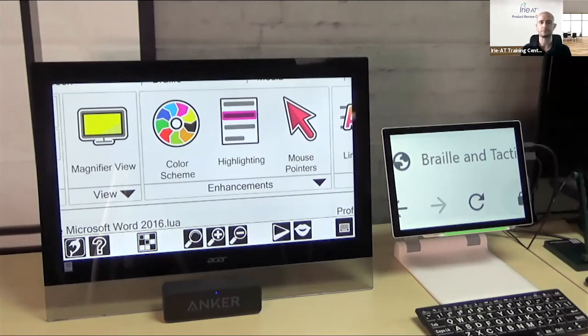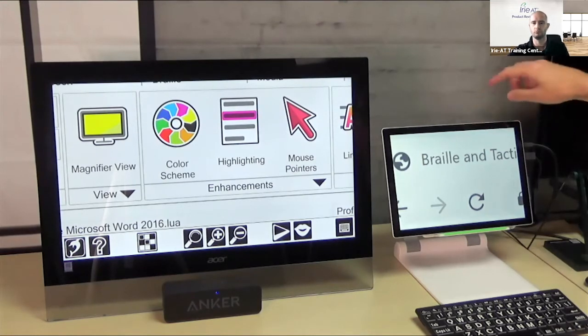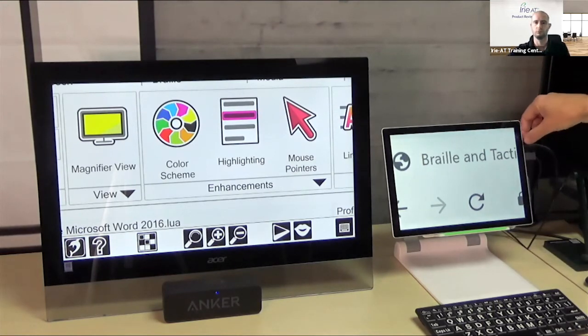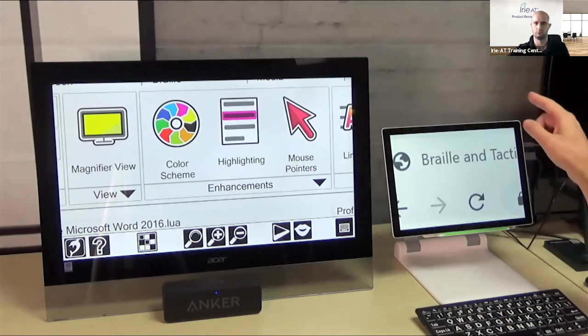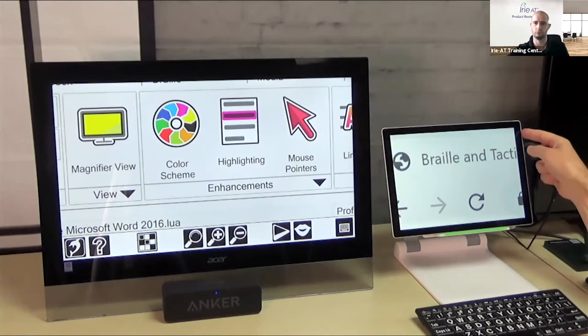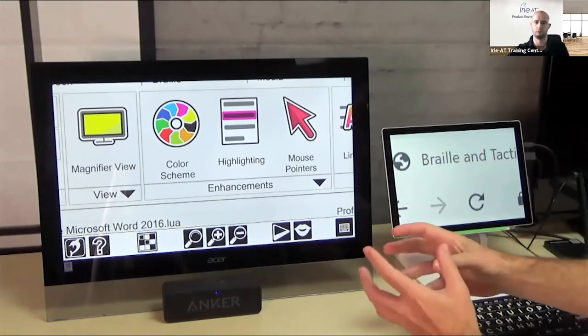So just to preempt any questions there, people are often trying to figure out what their computer can do. And this is relating really directly to what your computer can do. So in terms of this device, the Surface Pro, I have 1 monitor connection. Therefore, it's going to allow me to use 1 monitor. I can buy an external dock that allows me to split to more monitors, because it has another graphics card in it.